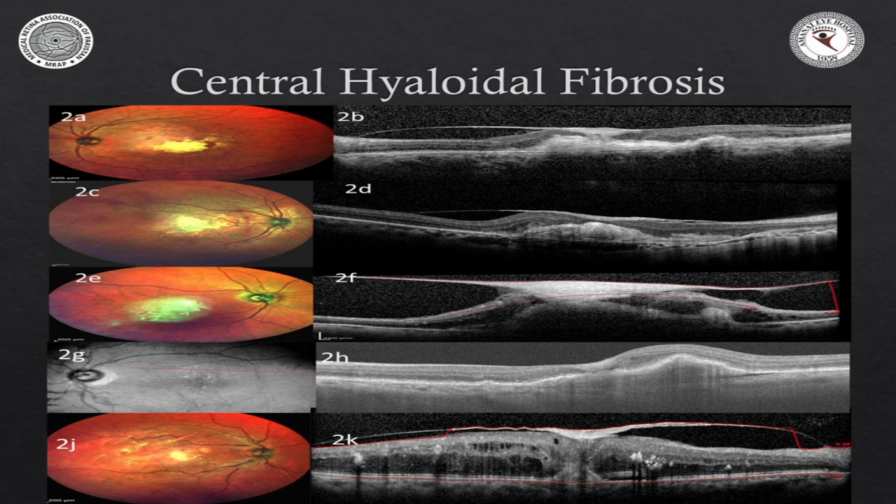Nobody's ever picked it up before, and we believe or theorize that it is because the underlying CNV possibly has some pro-fibrotic influence on the overlying posterior hyaloid membrane. So it always happens in advanced CNVs, always in CNVs which have an attached posterior hyaloid. There's always that debate whether vitreomacular adhesion somehow promotes CNV development. Although there are studies that negate that, there are other studies that found that if vitreomacular adhesion develops CNV, its release rate goes down. And somehow the CNV makes it a little stickier.